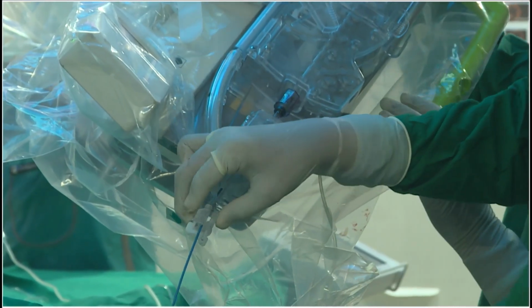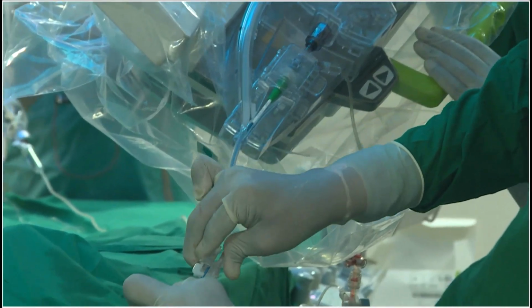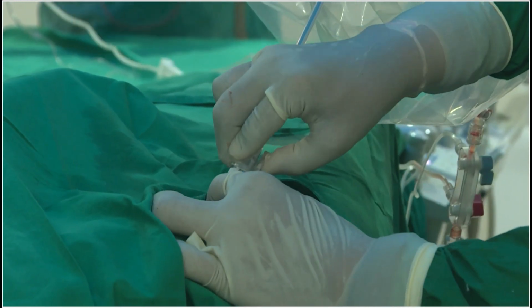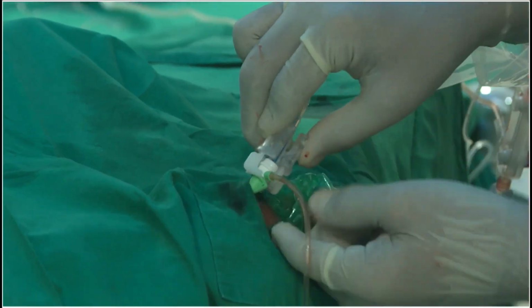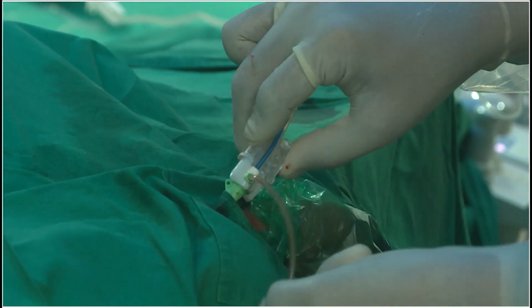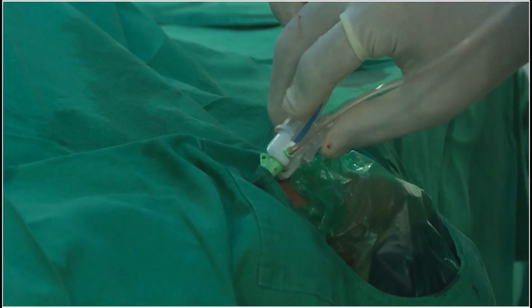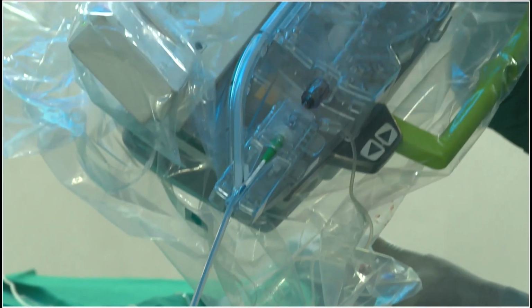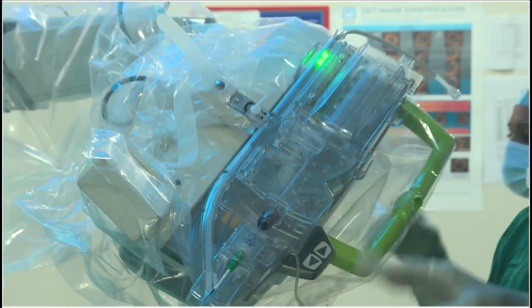So I'm pulling it down again. Yeah. So there is a lock over here, so we can have a guide attached to the sheath. You can see this lock. I'll just lock it. This is the lock position you can see now. So the instruction is, now the cassette is almost prepared. So we are prepared with the cassette.